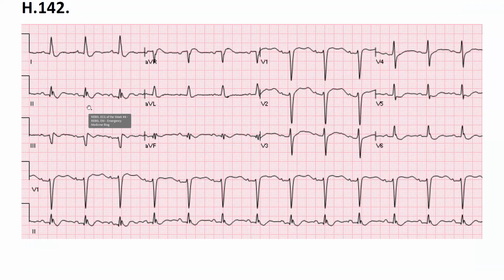So, it's rhythmic. We see around 80 BPM. And you see P waves, and they mostly seem normal, but there are some that have very, very small two peaks. I don't know if that's relevant. No, it's not relevant. Okay, wait a minute. I will draw you this picture. How does it look?